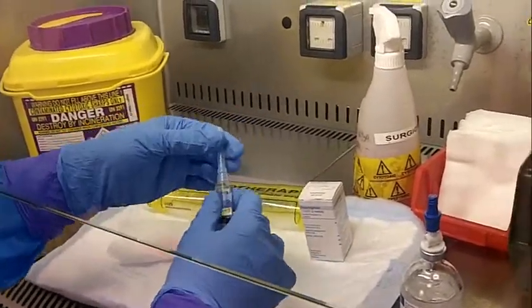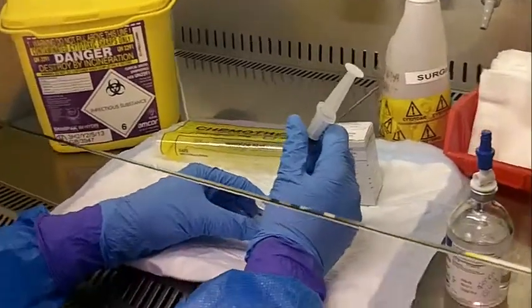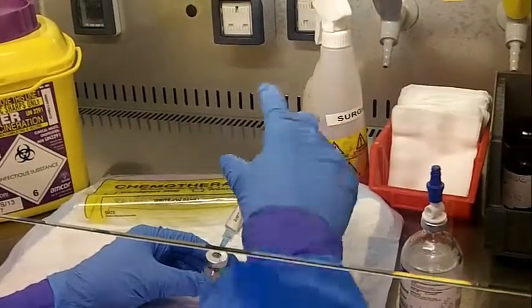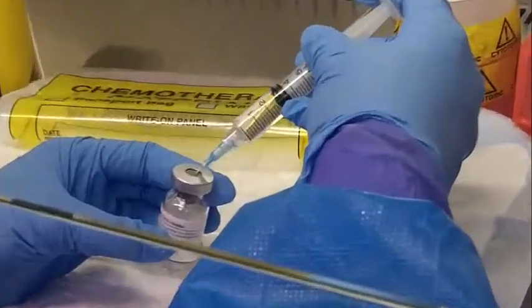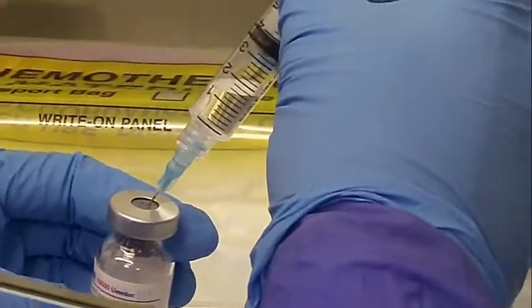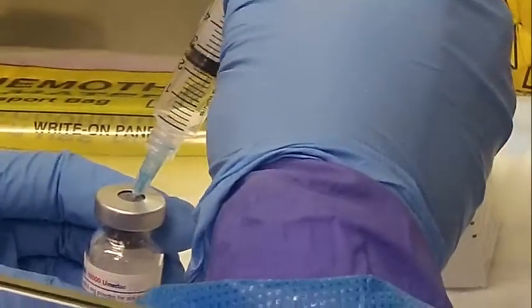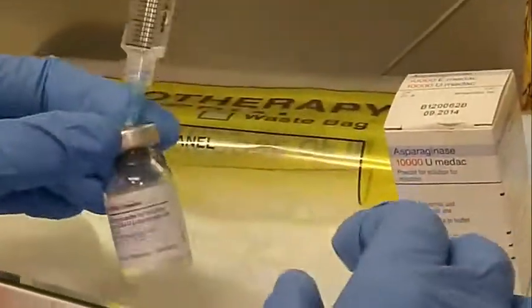So we've drawn out our water, and sometimes these vials are under pressure, so when you spike the vial, sometimes the fluid will get sucked in. These ones aren't, so what we want to do is inject the liquid down the side of the bottle, just slowly, so it trickles down the side. And we can calibrate the pressure just by letting the plunger go up, because if you think you're injecting the water in, the air has to go somewhere to replace the water that you're putting in. So I tend to leave it like that.